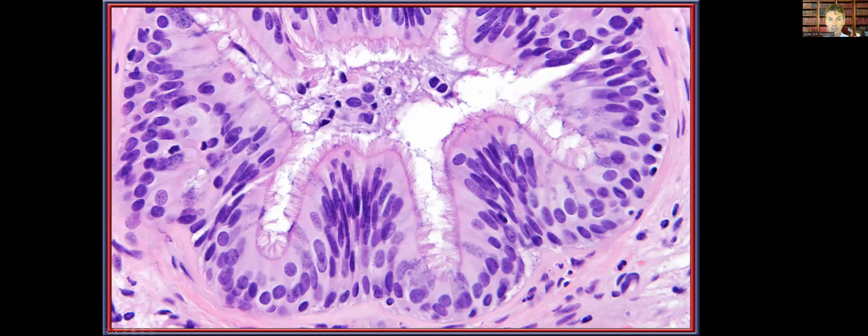And then, of course, when you look at the central component, respiratory epithelium is present. You may have this kind of tufting or serration that develops within the central part of it, showing a very nice ciliated respiratory epithelium. As you know, the vast majority of things that have cilia in them are benign. Of course, there are always exceptions, and there are some adenocarcinomas in the sinonasal tract that may have cilia, including some of the mucoepidermoid carcinoma category.